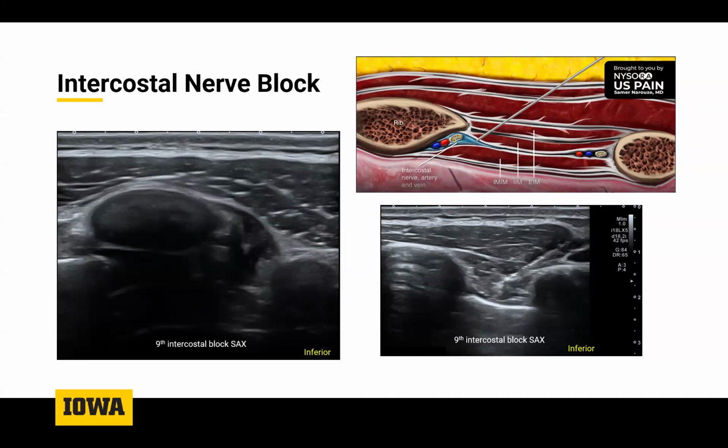Right. Does anybody out there have any experience with, again, traumatic onset of pain, high yield with ultrasound? The other area is noise and clicking, and they can reproduce that click. Oftentimes I've been able to establish a diagnosis. One other little caveat I was going to add: when I count ribs and I see an abnormality, I tend to count both ways, just because of the variability of the sixth through 10th ribs, so I will confirm going the other direction also.